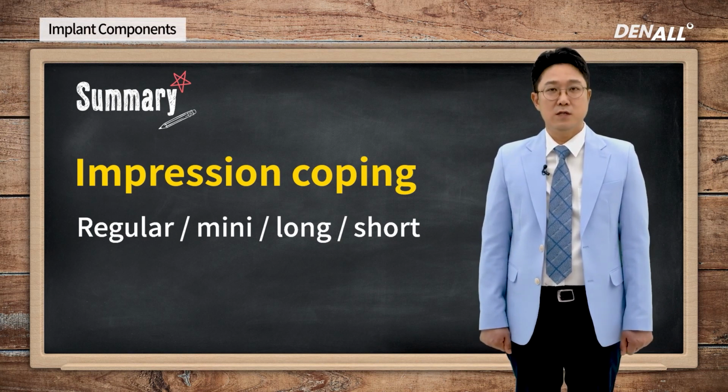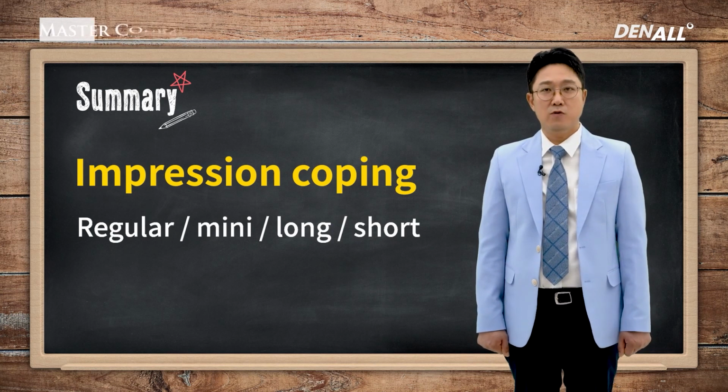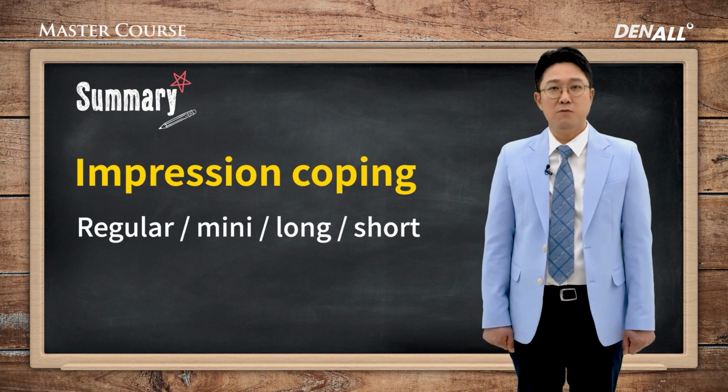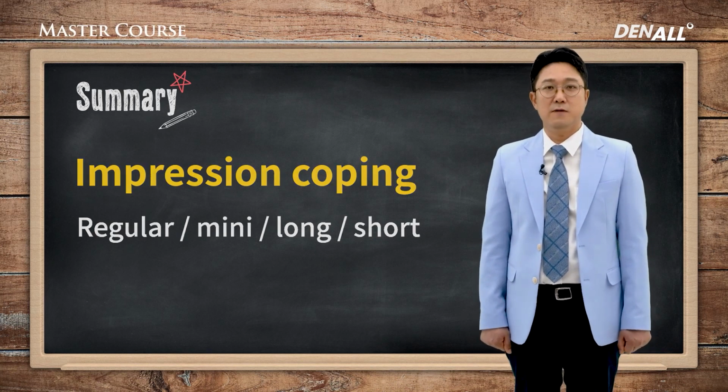You need to use it well and differentiate them. If you choose wrongly, at times you may not be able to take impression. Please differentiate them and choose wisely.